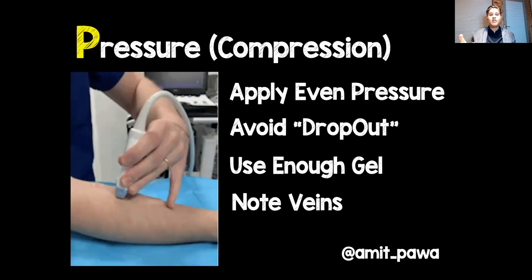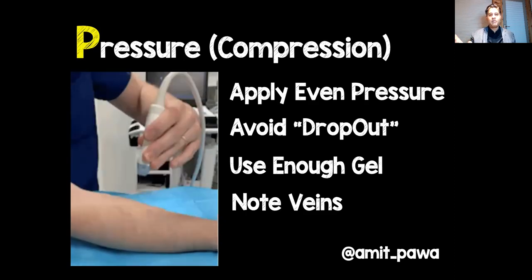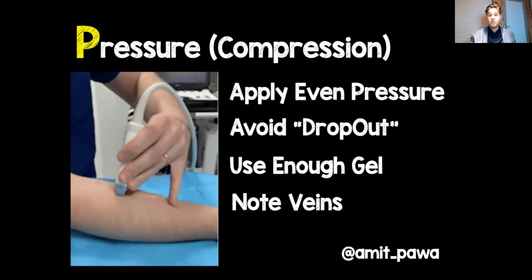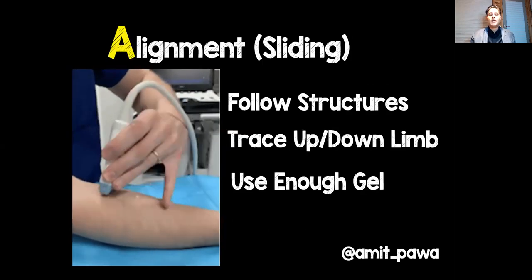Now, clearly, there's a point if you apply too much pressure when you occlude the veins. There's a happy medium between applying a decent amount of pressure to get a good image. Sometimes you can perform a block with the veins compressed, but it's important that you should know where they are.